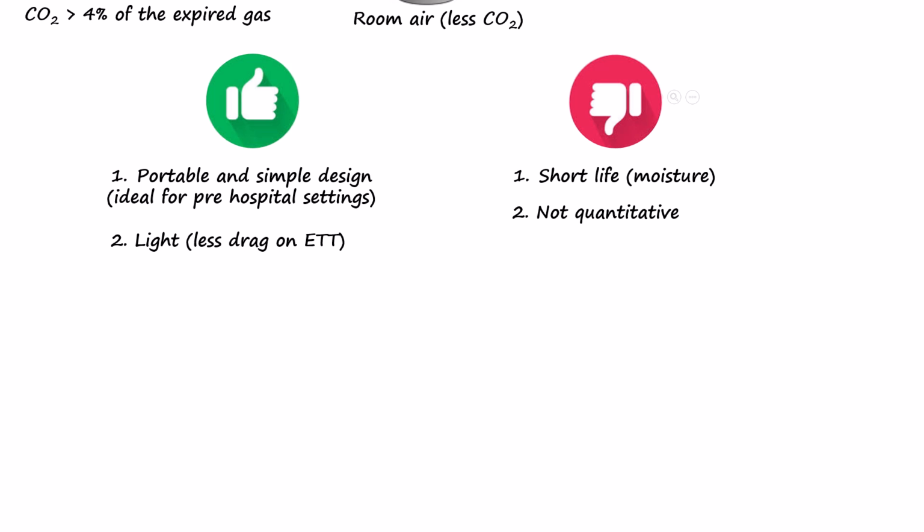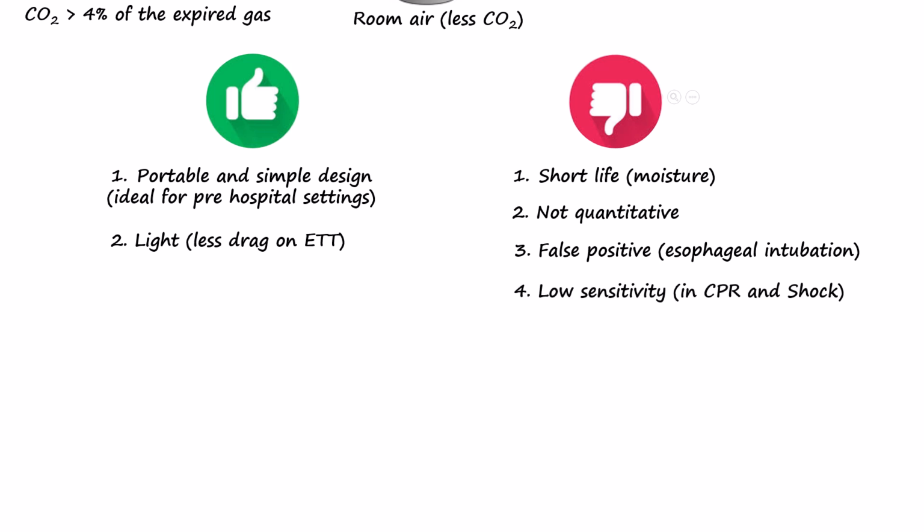Furthermore, in the event of esophageal intubation, they may show a false positive result from carbon dioxide if the patient has recently consumed carbonated beverages. They are also not sensitive to low concentrations of CO2, as may be seen during cardiopulmonary resuscitation or in low cardiac output states.